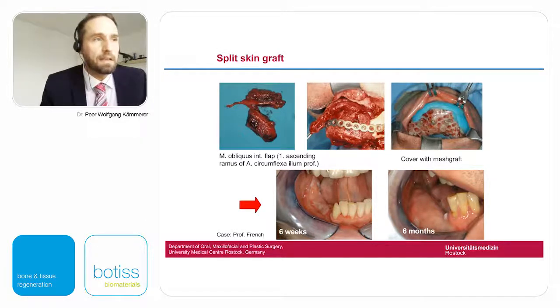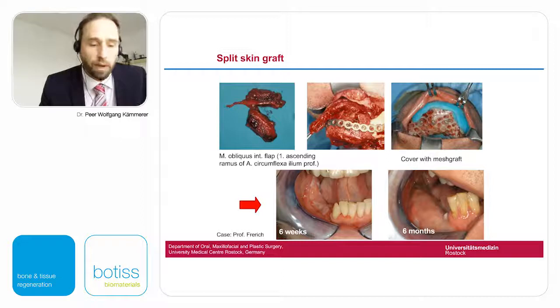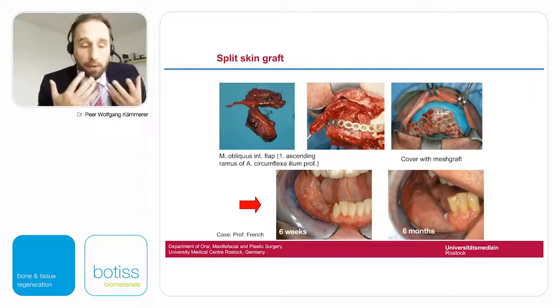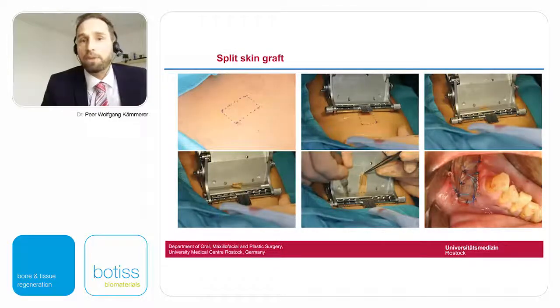It has to be seen here. The functional result is quite good, but it has a different color, and the texture is different from normal mouth epithelium, of course. And in the first years after grafting, there might also be a bad taste or odor, probably resulting from the presence of hair and glands in the graft, and maybe also from insufficient oral hygiene. And there's also the development not of scars in the mouth, but scars at the donor site, and they're also a certain kind of discomfort.